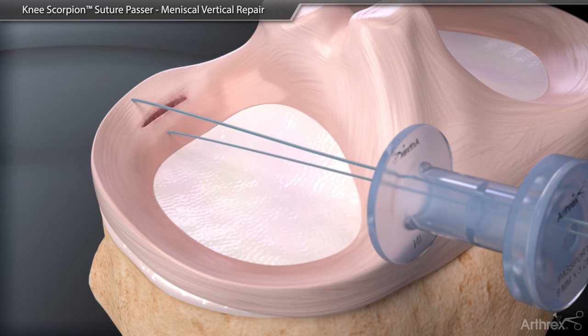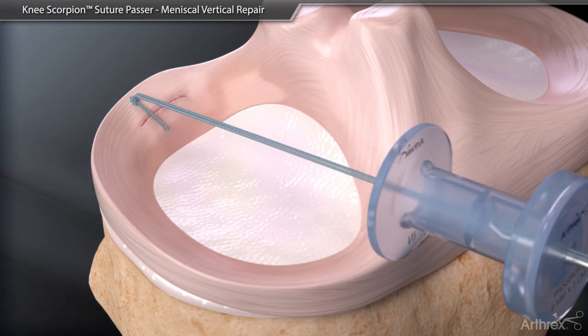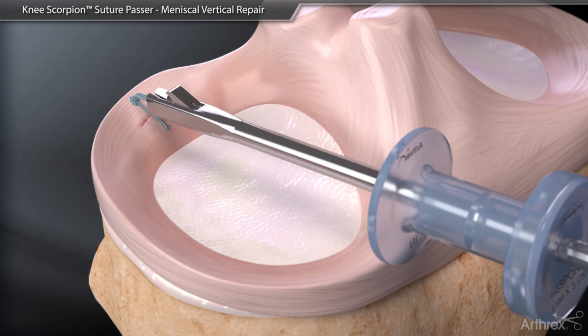Remove the suture from the Knee Scorpion. An arthroscopic knot of the surgeon's choice is completed. Using a knot pusher, it is ideal to push the knot posterior and recessed in tissue. Introduce a suture cutter to sever the suture flush at the knot.